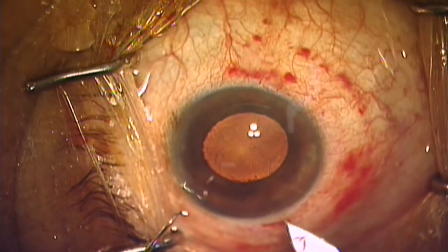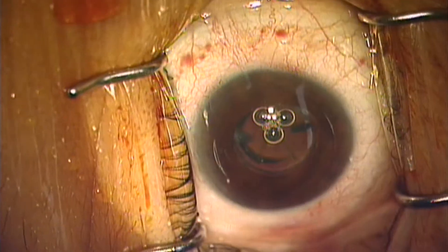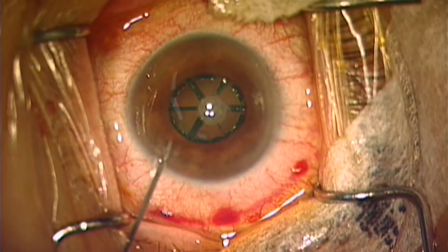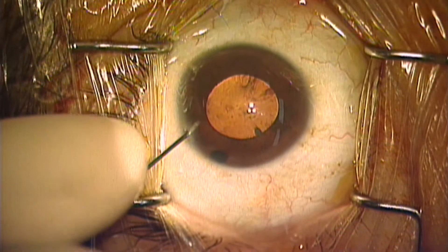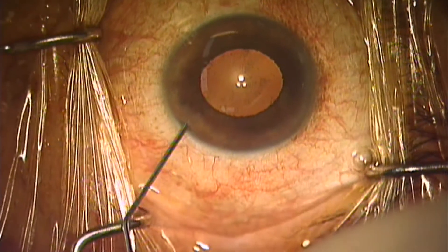There are patients who have difficulty with mydriasis, such as those who have diabetes or take prostate medication. For safe cataract surgery in these kinds of patients, you can inject mydriatics during surgery. Now, let's have a look at a very simple way to make mydriatics take effect quickly.